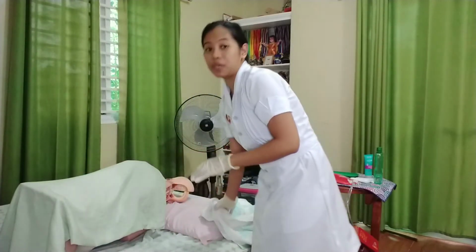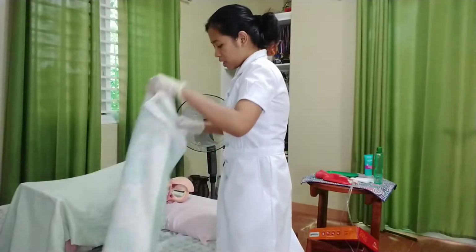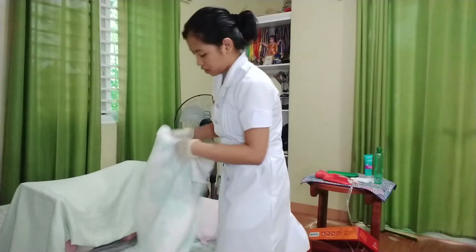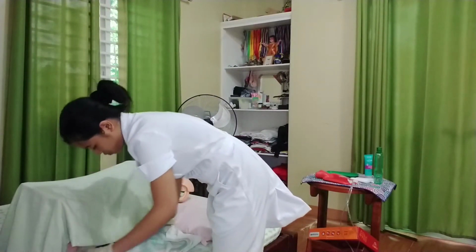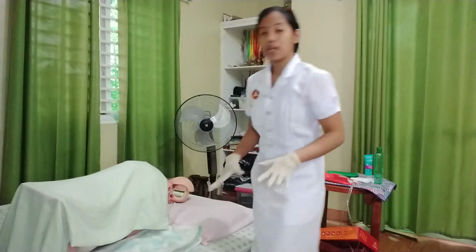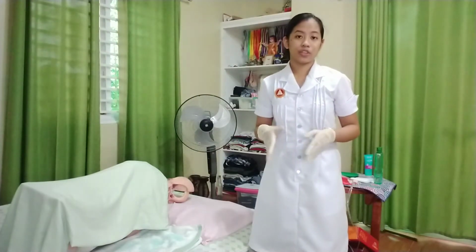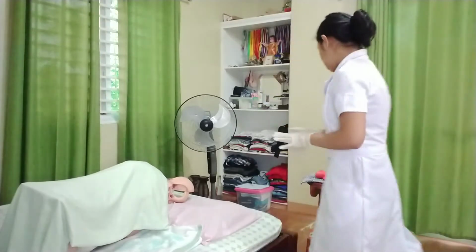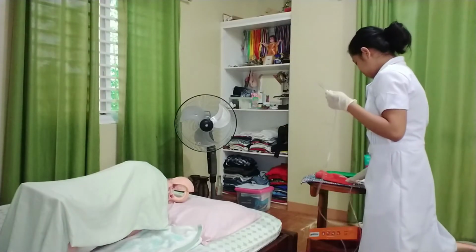And then I will be placing the disposable linen saver pad under the buttocks area. And then after that, I will now start inserting the enema tube. So we have here our makeshift enema tube.